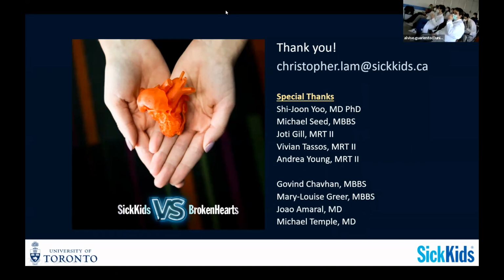Thank you so much. I was writing in the chat. There was one question from the audience about the type of contrast that you use for these tests. For the MRI test, it's just a basic gadolinium, so basic MRI contrast agents. But for conventional or CT lymphangiography, you'll be using an iodinated contrast agent. All right, I'll give the word to Elena Raffo, who's the expert here in cardiac radiology.